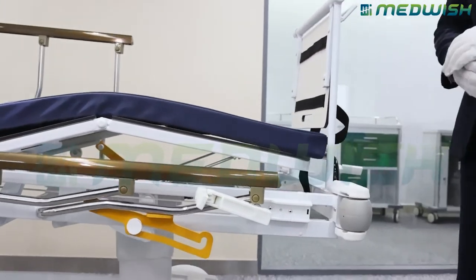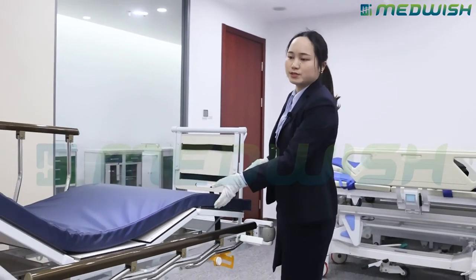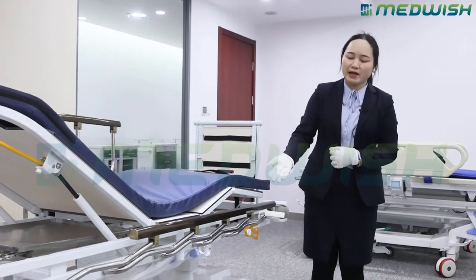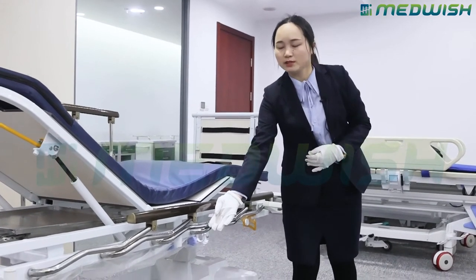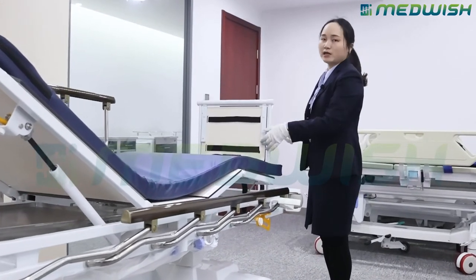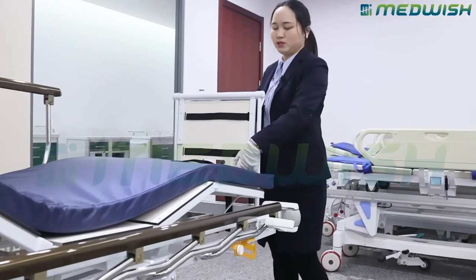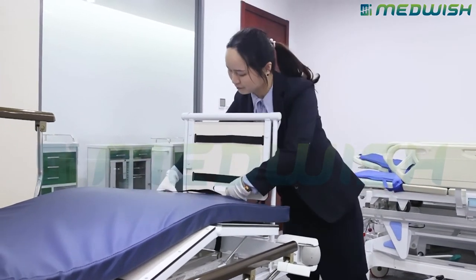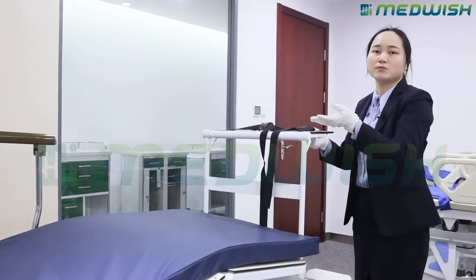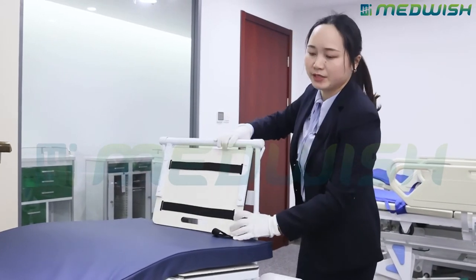For the accessory part of the stretcher, we provide a five centimeter mattress. Also one IV pole hidden under the bed board. For the monitor shelf, it is an optional choice — detachable and foldable design. You can put a patient monitor or defibrillator here. Very convenient.